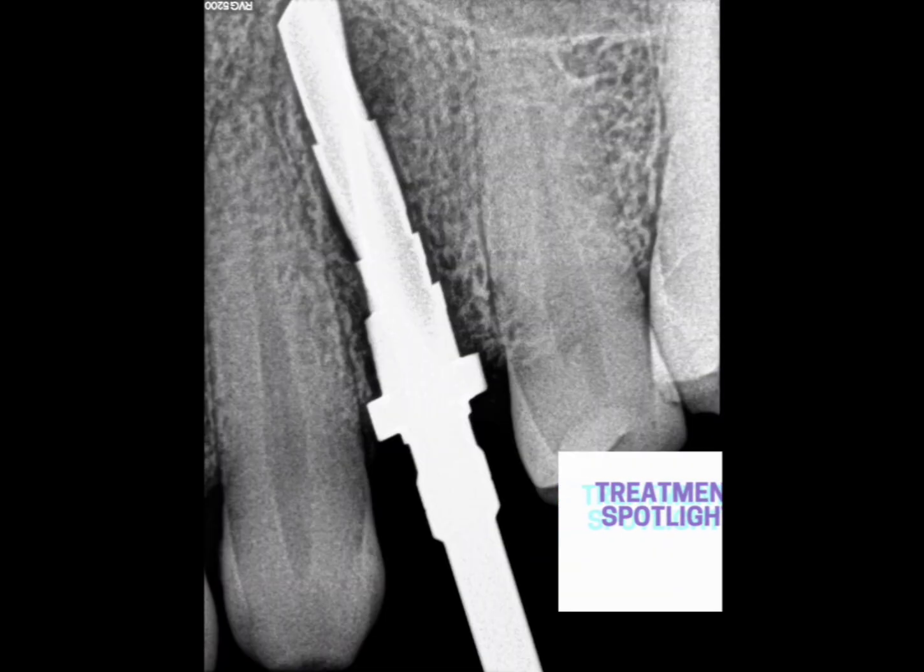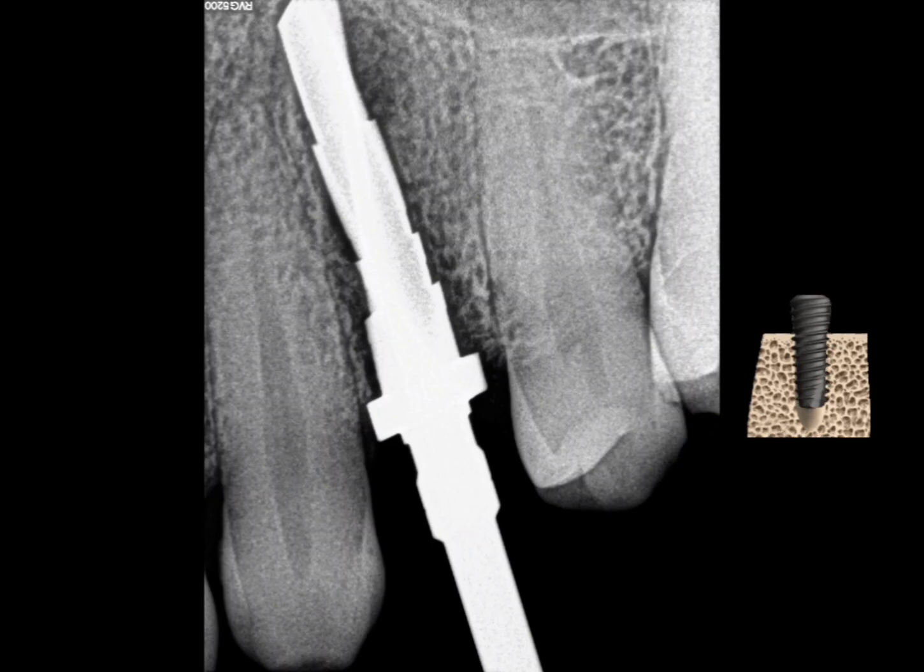Surgical phase. After administering local anesthesia, an atraumatic extraction was performed to preserve the remaining socket walls. A full thickness flap was reflected. All granulation tissue was meticulously removed from the socket. The site was thoroughly irrigated to reduce the bacterial load.